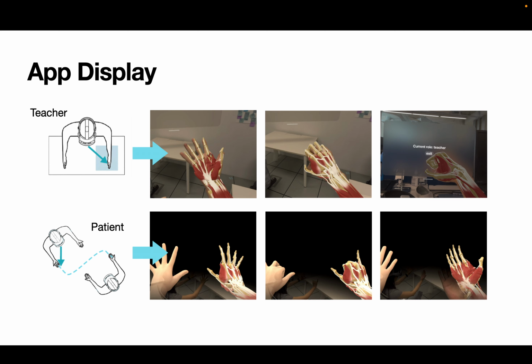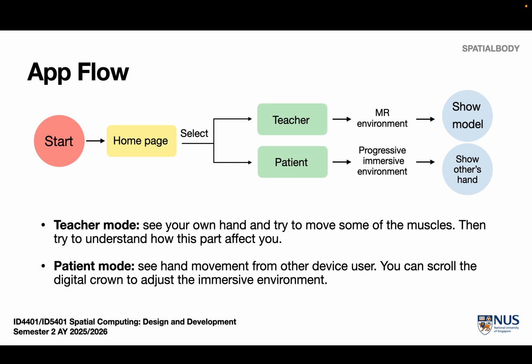And this is the overall display screenshots of the app. I divided them into two modes. In the teacher mode, you can see the virtual model is overlapped on your own hands and can follow the very subtle movement of your hand. And for the patient mode, you are brought into a progressive immersive environment. In this field of view, you can see other users with another Apple Vision Pro doing the exercise demonstration in front of you.